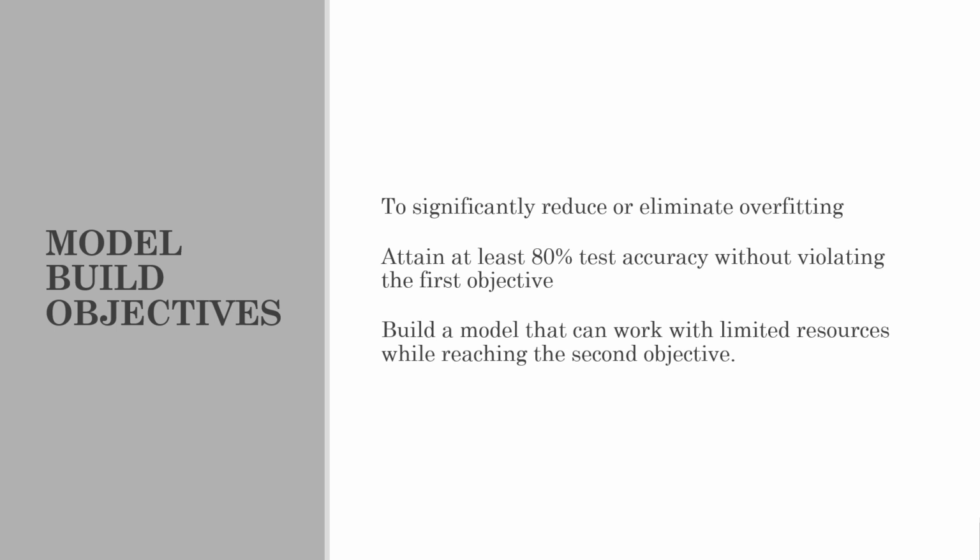The major problem is that the data is heavily biased in favor of a single class of 7. Because of the imbalance and a focus on a minority class, specifically melanoma, we will also be looking at the macro average in the classification report.